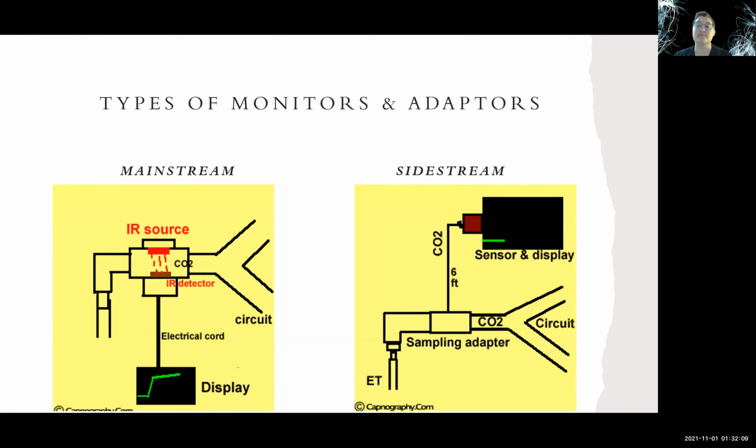Now, CO2 can be measured in three main ways: colorimetry, capnometry, and capnography. Colorimetry provides continuous, semi-quantitative end-tidal CO2 monitoring. It has three color ranges: purple being less than 0.5%, tan 0.5 to 2%, and yellow greater than 2%. When using colorimetry, normal end-tidal CO2 readings are going to be greater than 4%.